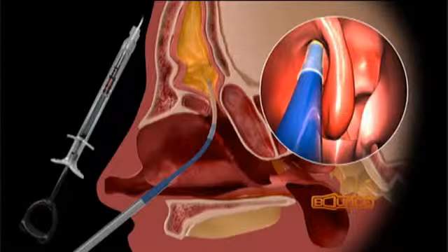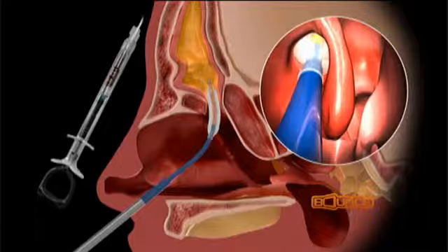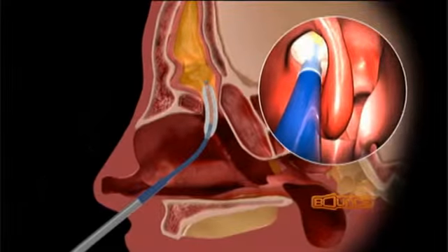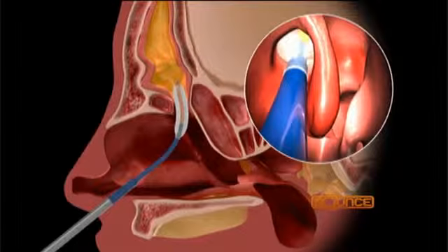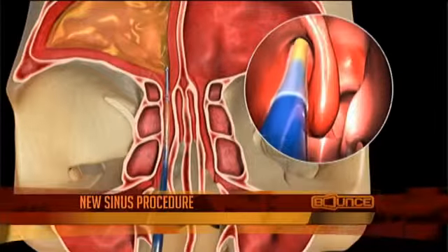Now, once you do this, what's the downtime for this kind of process? I allow my patients to take the afternoon off. Just the afternoon? They usually go back to work the next day. And typical sinus surgery before, it really took some time. It was invasive, yes? It is invasive, and this does not replace conventional sinus surgery. This is a procedure that's meant to help certain select cases where it's applicable. It does not replace or supersede what we were already doing in the operating room.